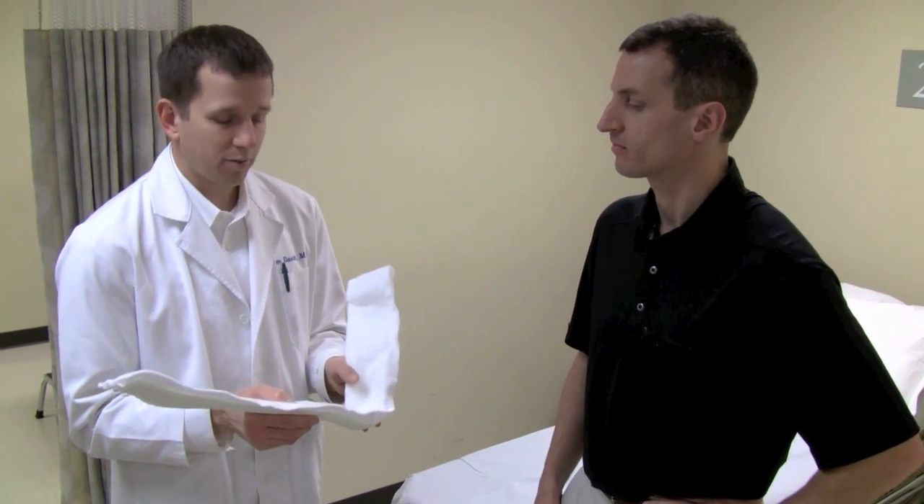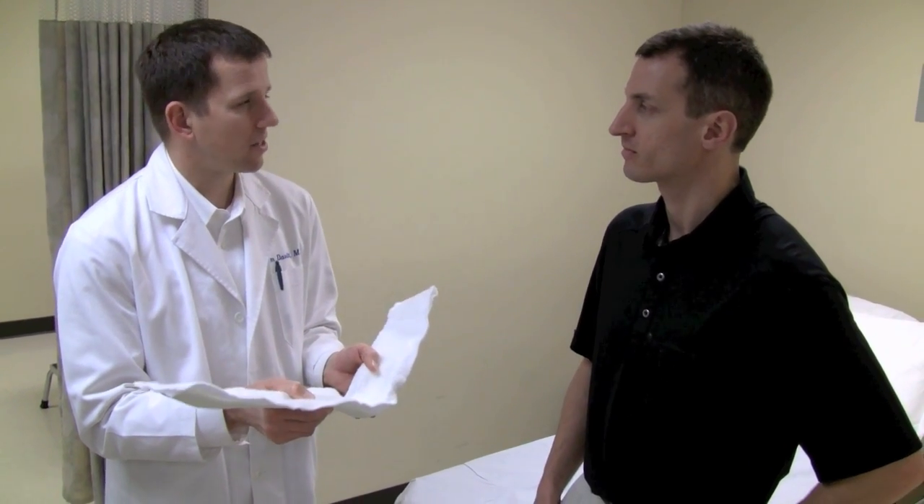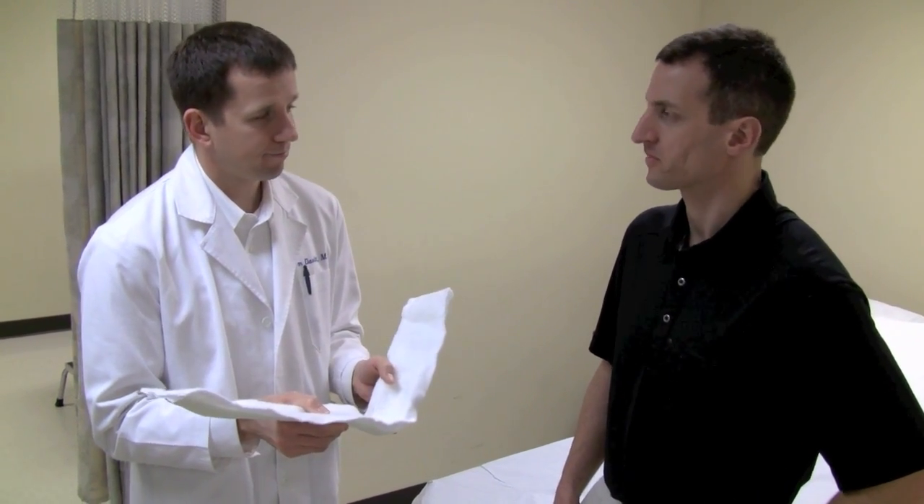For things like Achilles injuries, which are pretty common in the emergency room, it's great to have the foot down in a little bit of equinus because that just makes it more comfortable for them.